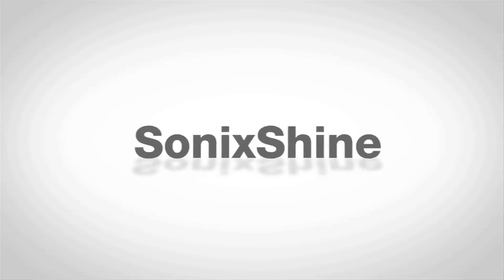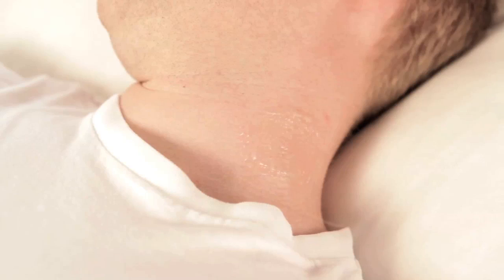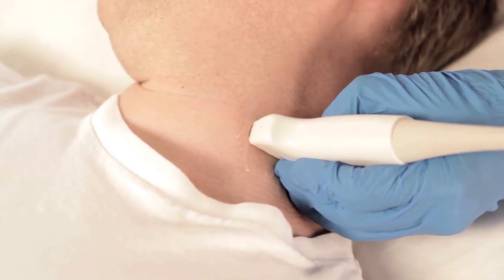SonixShine Needle Enhancement Technology from Ultrasonix helps you clearly see your needle as it passes through the tissues for in-plane procedures. To use SonixShine, position your transducer over the area of interest and begin your in-plane needle-guided procedure.